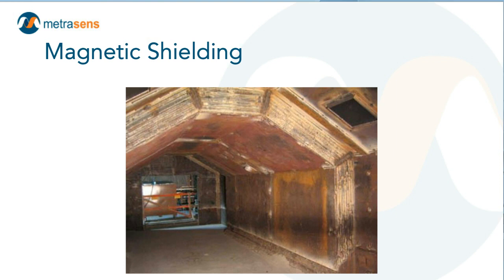So siting MRI equipment becomes really important to make sure that we follow best practices for siting.